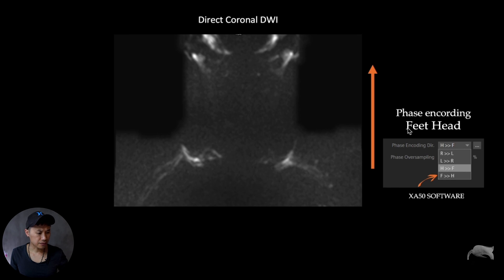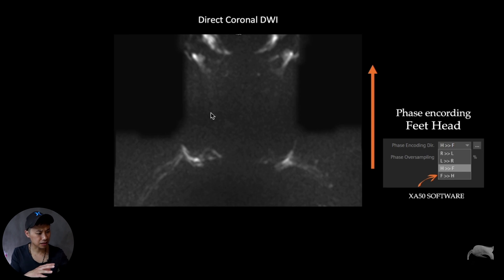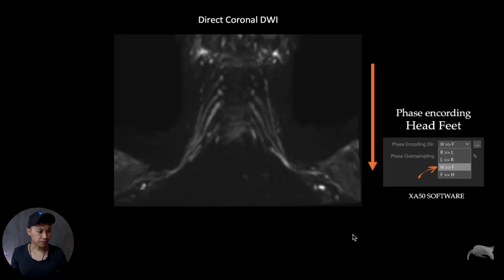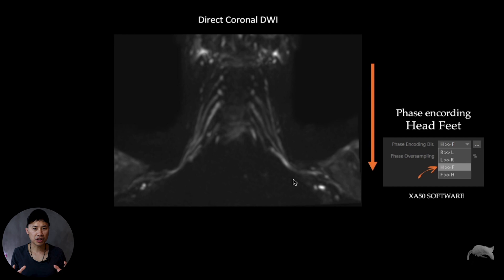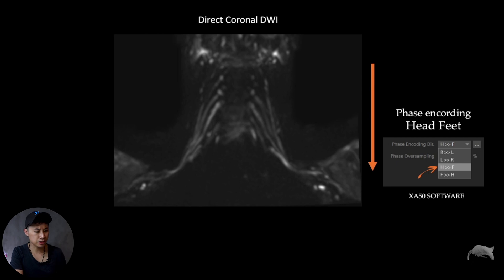You can see the phase encoding direction here is feet-head, which is more like the standard. But you can see there's a lot of distortion and you don't see the nerves at all. But look at this — just swapping the phase encoding to head-feet, and you see the nerve structures are great. A little bit of distortion of course, but much lesser compared to the other images. Swapping the phase encoding direction gives you images like this.